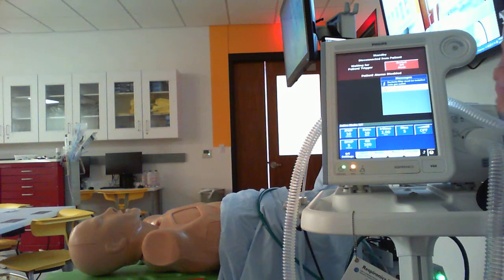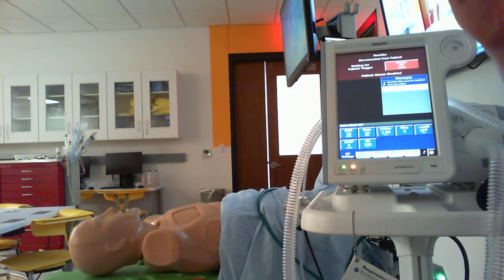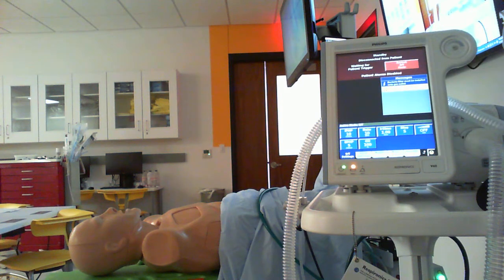So this would be after we've confirmed the patient has an indication for non-invasive positive pressure, or BiPAP in this case. We've made sure they meet criteria. We're trying to either fix an impending respiratory failure, an active respiratory acidosis, something along those lines. And then we're going to go ahead and initiate here. So I'm going to talk about some initial settings.